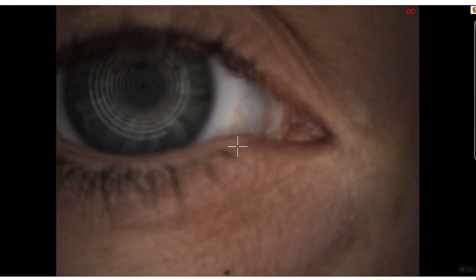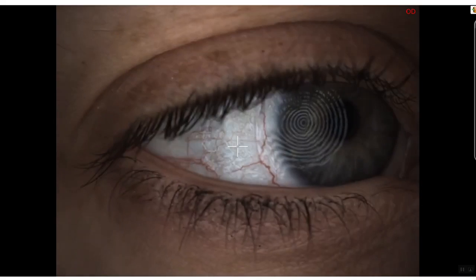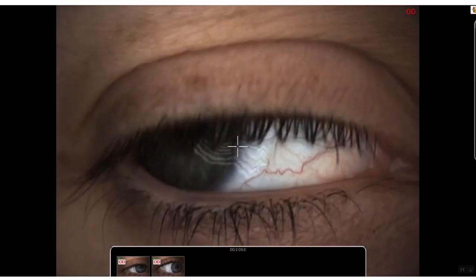And we'll do an image of the patient. Look straight in front of you. And look slightly to the left. Okay. Left, left, left. Okay, and then we just have to focus the image and click the button. I like to take an image. Look to the right, please.